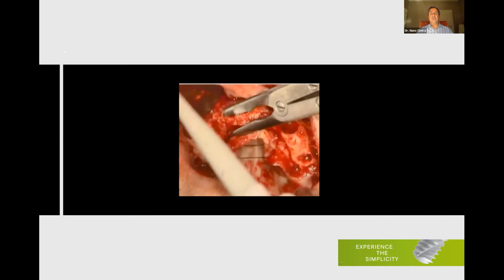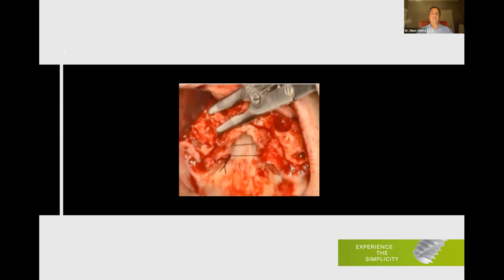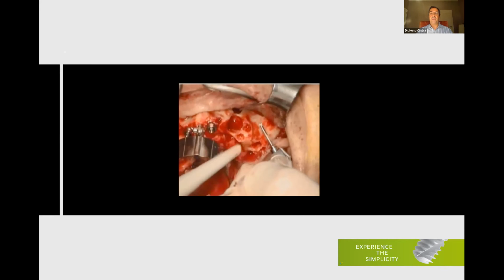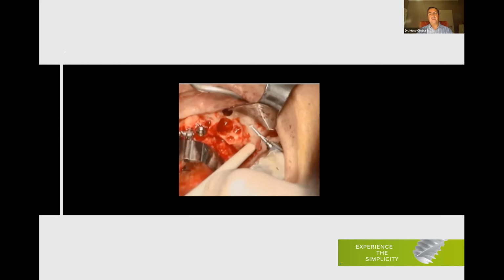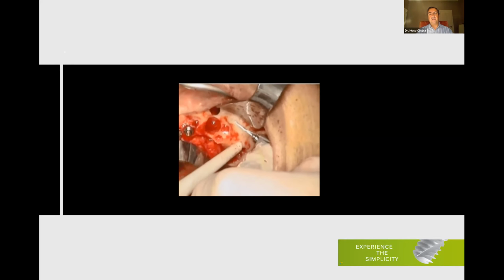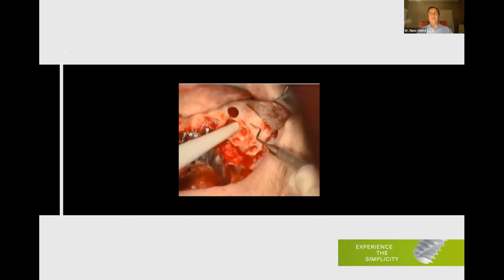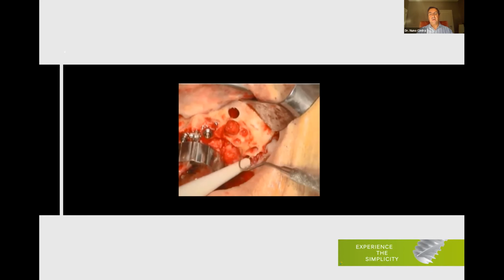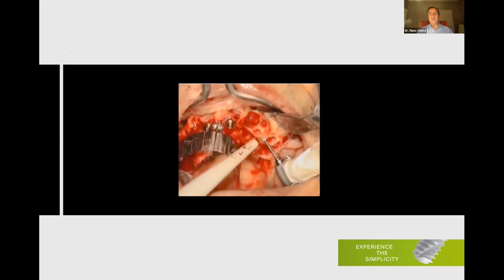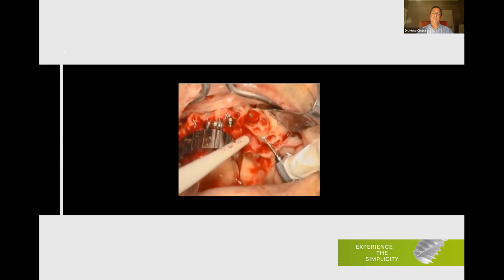We have plenty of bone, so we can keep some bone to regenerate this region. And there we go, we are opening the sinus, okay? As you can see, there is the membrane. Don't perforate the membrane, just check where the anterior wall is. So, as you can see, the lesion is right on the path of my posterior implant. So I have to go through the lesion.